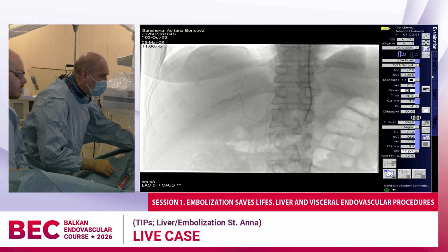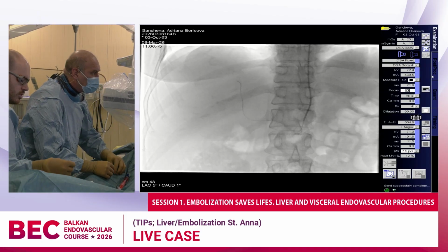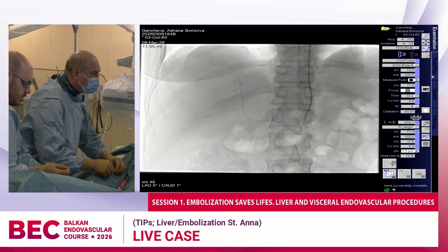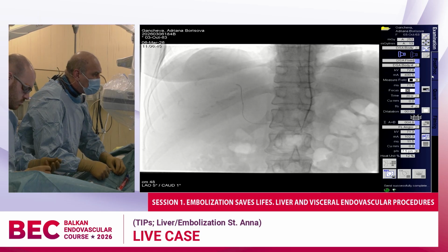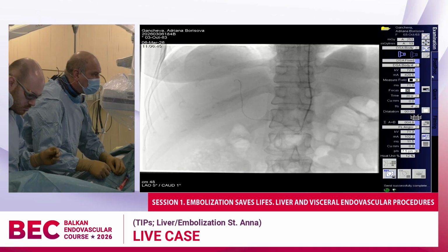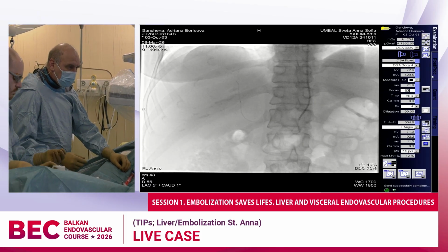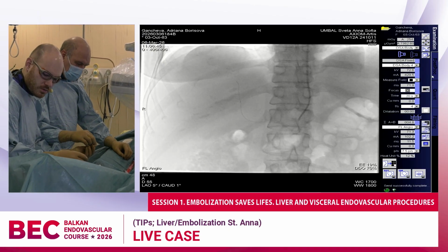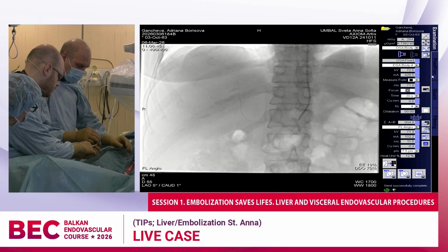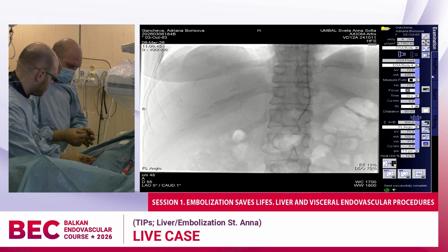Okay. Should we try with the coronary wire? Now this wire is a little bit too stiff. One hint from the radiologist, because I have a talk after lunch time about radiation protection: I would use the shutters a little bit more from the side. That saves radiation, scattered radiation.